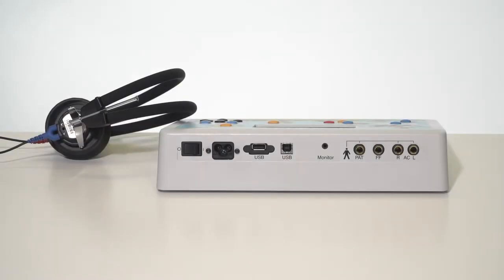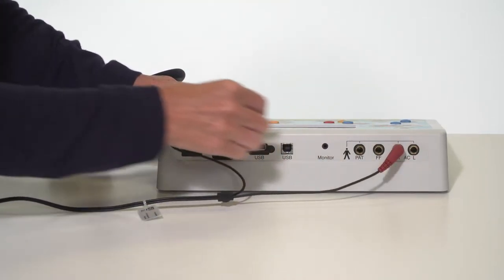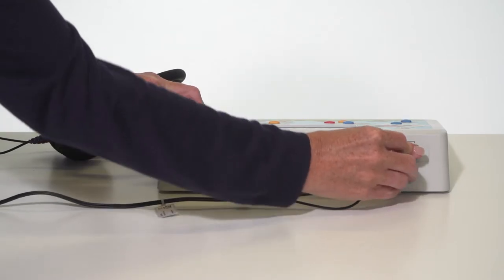Before using the device, plug in the headphones ensuring the red plug is inserted and fully seated into the jack labeled R, and the blue plug is inserted and fully seated into the jack labeled L.